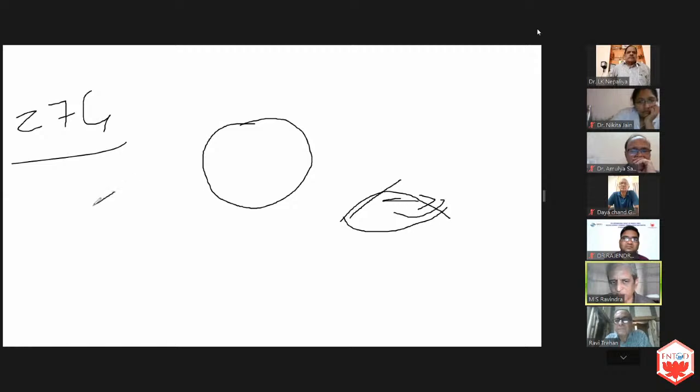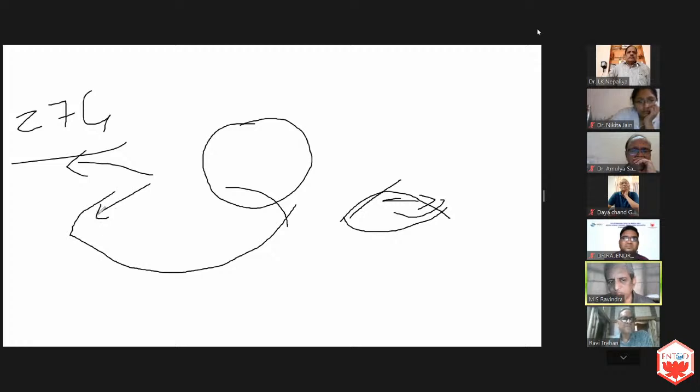If you want a successful hydrodissection, the direction of the cannula should not only be lateral, but also downwards in that direction. Just two drops of fluid is enough for the fluid to go, hit the equator and come back here. This is the secret of doing good hydrodissection.